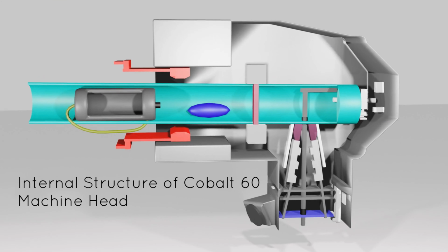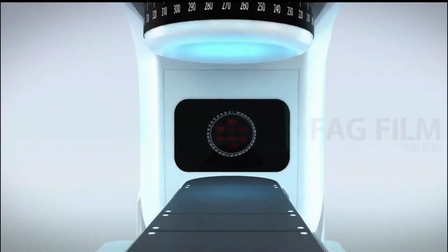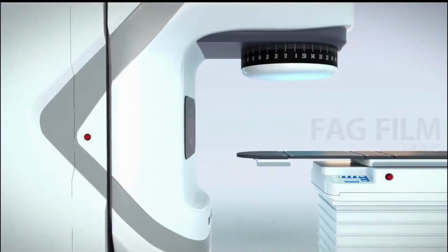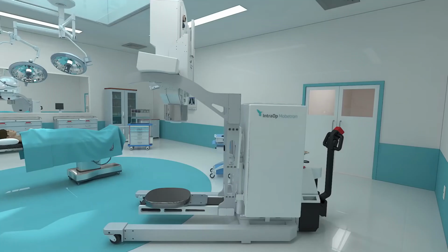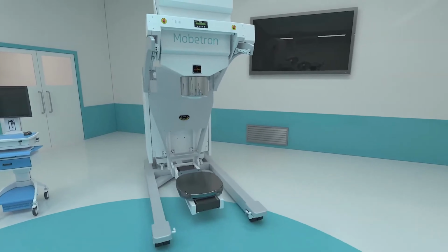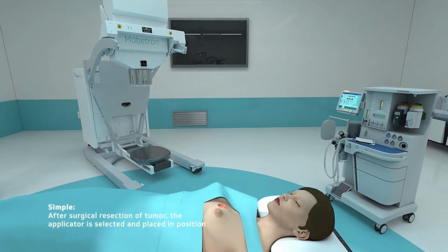Let's look into the application of cobalt-60 radiation therapy. Cobalt-60, or 60Co, is often the ideal mode of radiation for treating laryngeal cancer. For primary treatment of laryngeal cancer, 60Co allows adequate dosing of the superficial tissues. Historically, great concern has been expressed that 6 MeV photons have too large a buildup region and can potentially underdose superficial tissues. Most radiation oncology centers only have linear accelerators.